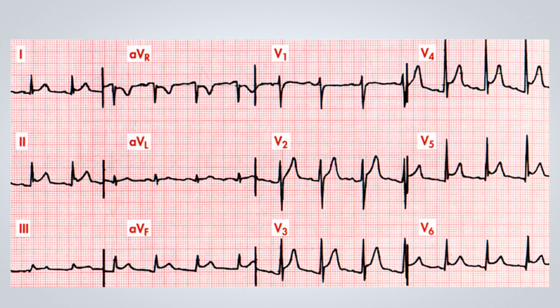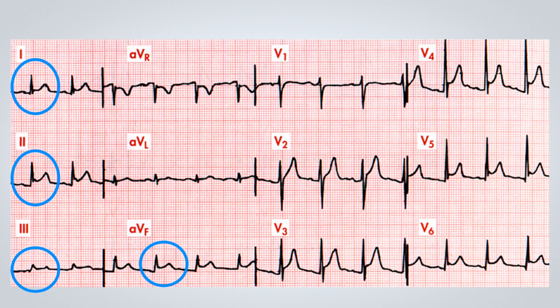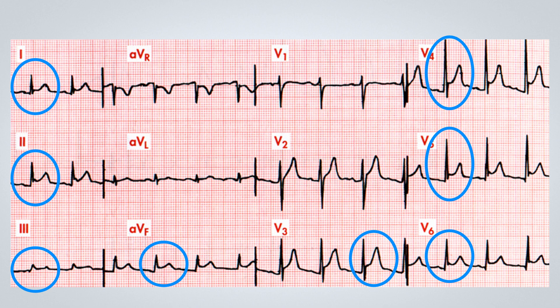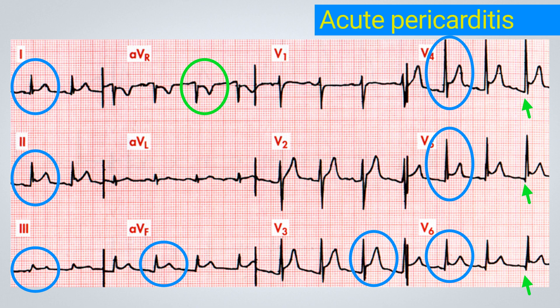Returning to the first tracing for discussion, we can observe a sinus rhythm with no alterations in the QRS complex axis or the QRS complex itself. Upon examining the ST segment, we can see an elevation in nearly all leads, most prominently in D1, D2, D3, aVF, and from V3 to V6. Additionally, we observe a depression of the ST segment in aVR, associated with an elevation of the PR segment in aVR and a depression of the PR segment, particularly in the lateral wall from V4 to V6. This case is highly consistent with an acute pericarditis presentation, as there is ST elevation in almost all walls except aVR, where we have a depression. This ECG is strongly suggestive of acute pericarditis.